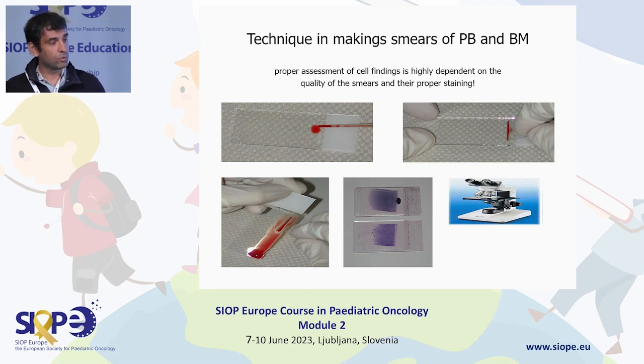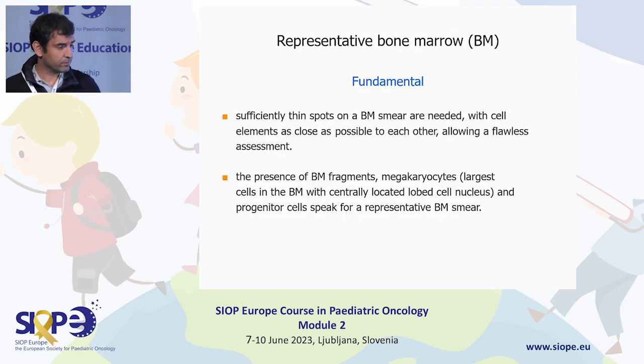Knowing the proper technique and the staining is very important, because this will allow you to have a proper assessment of the cellular findings.